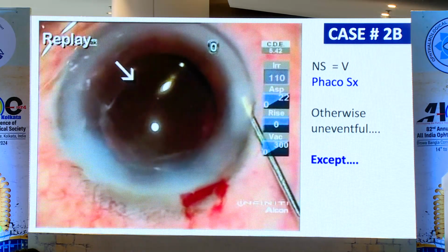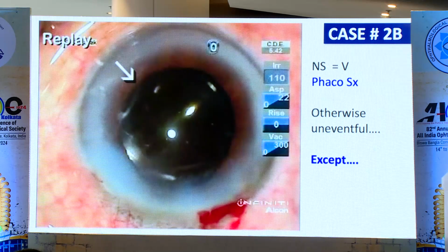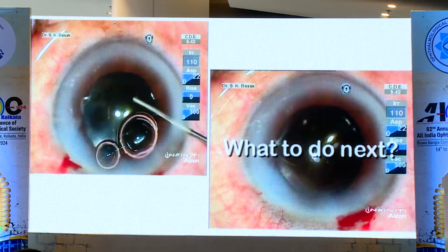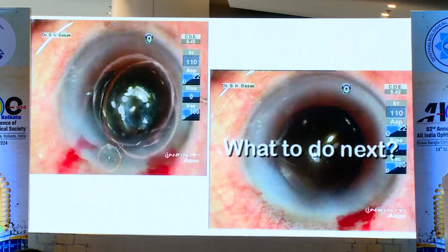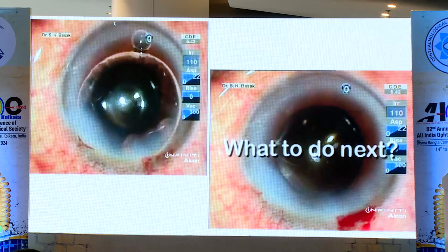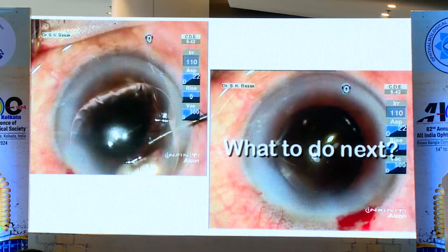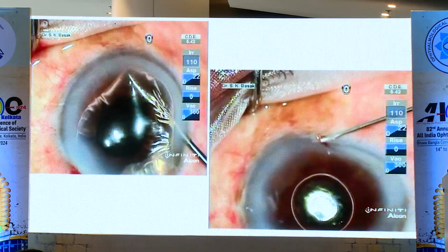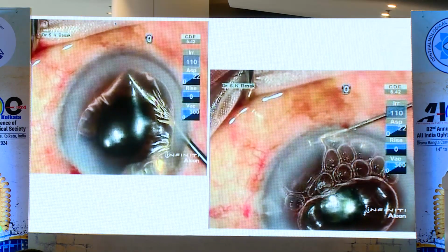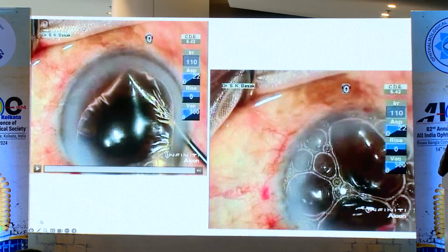So this can happen during surgery. Then you should go for the total air tamponade. So what next? Just put air, make a tamponade, keep it. Suture the incision, keep it tight, and the next day it will be fine. Within 2 to 3 days it will be fine. Here it is putting the air probably in between the cornea and the Descemet. So you can see it is like a big bubble.